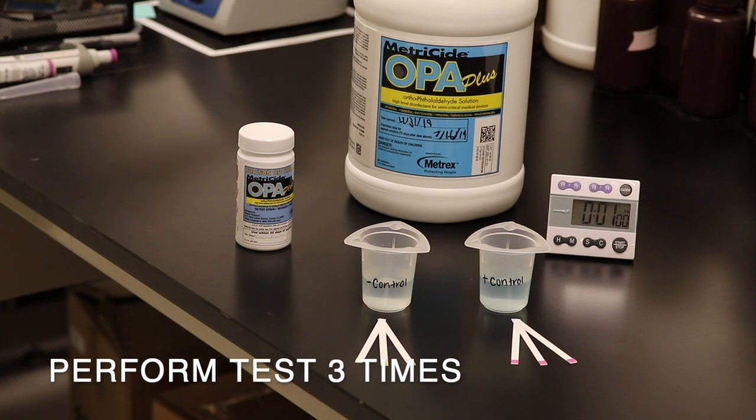Repeat the positive and negative control test two additional times each, for a total of six quality control tests. In order for the Metricide OPA Plus test strip bottle to pass the quality control test, all six tests must indicate the proper result.